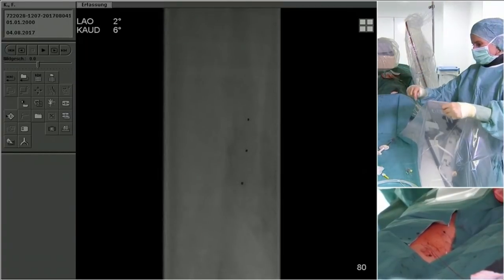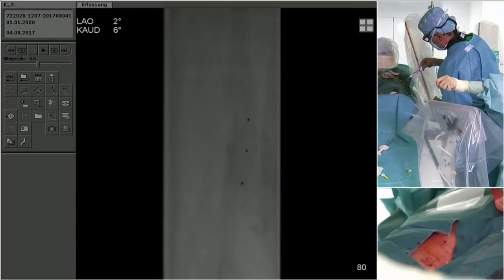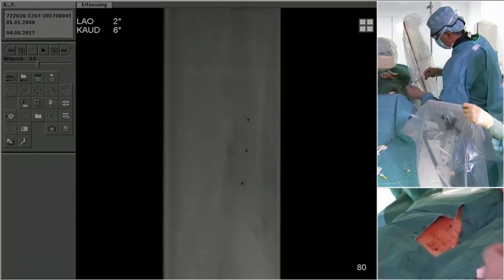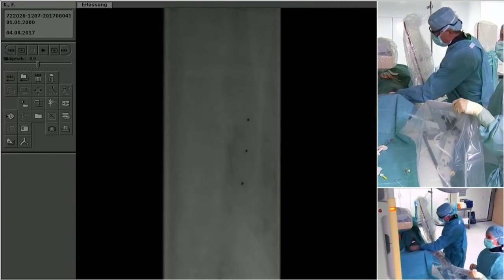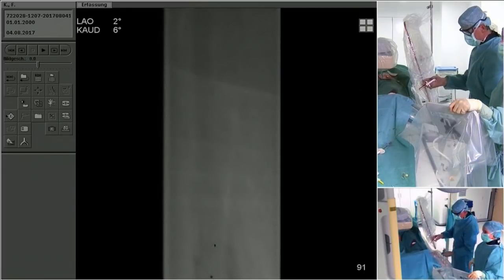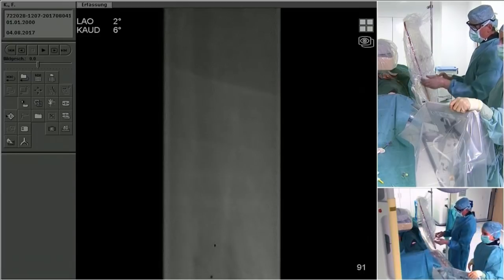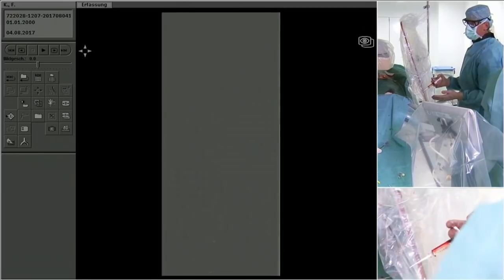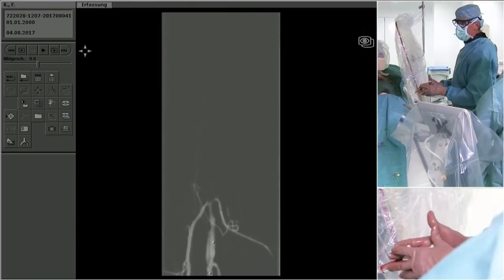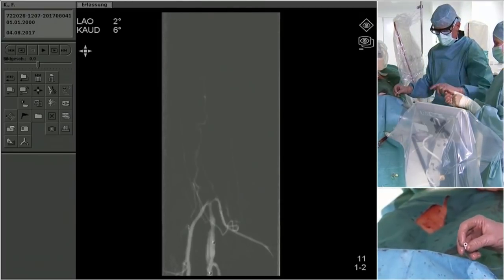But now you can see there is some reddish blood coming out of the catheter, and I will inject now. We are relatively deep now in the SFA but still I'm in the diseased segment. So at the end, once we are hopefully successful, I will balloon over that access area, and even if I have a 6 French sheath in, that should then not be a problem of bleeding.